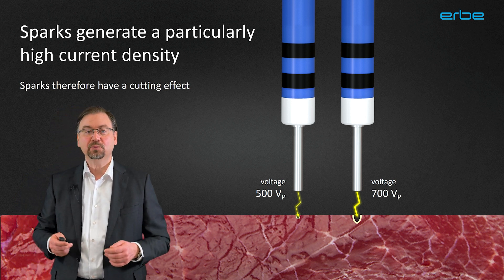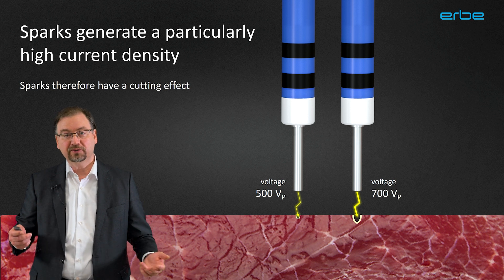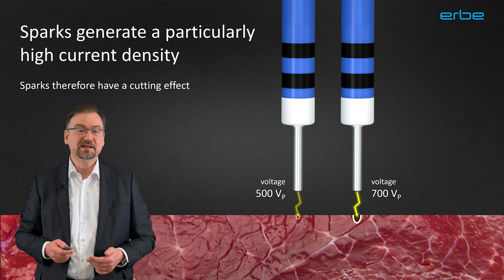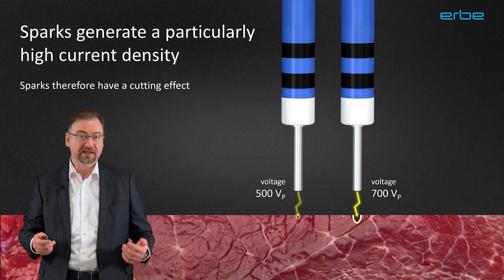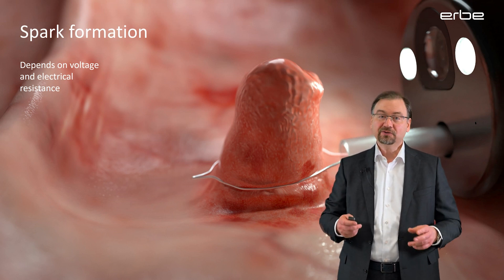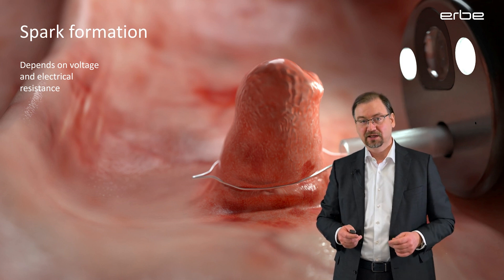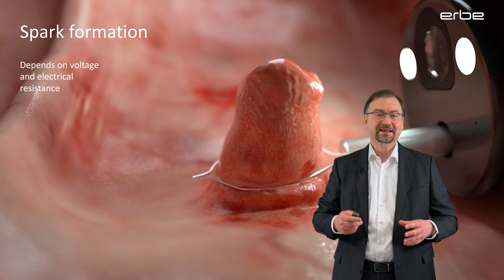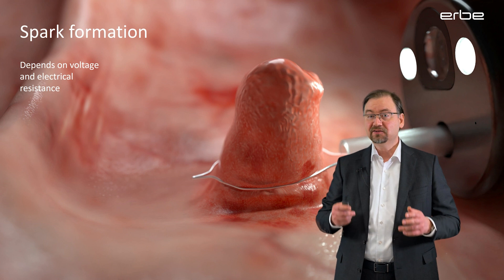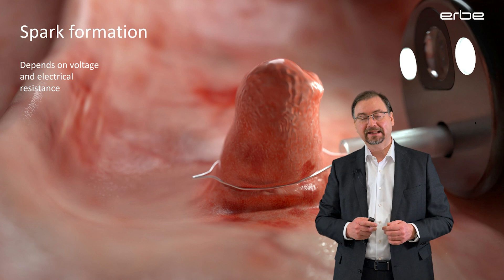Depending on the selected mode, usually when the voltage is increased, the sparks become stronger. The stronger sparks will vaporize more tissue, resulting in a sharper cut and a wider coagulation seam, and also resulting in an intensified hemostatic effect. The spark formation also depends on the electric resistance at the point of contact. If the resistance is very low, the current can easily flow between the electrode and the tissue without producing any spark. Sparks will only develop when the resistance and the voltage are both high enough.